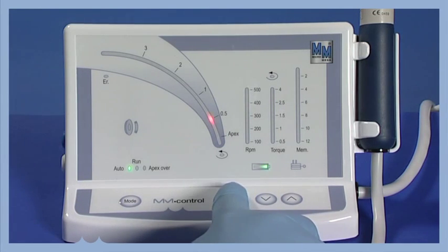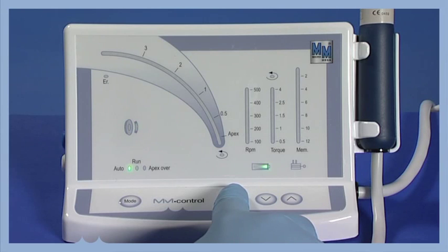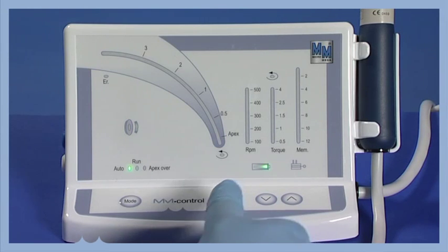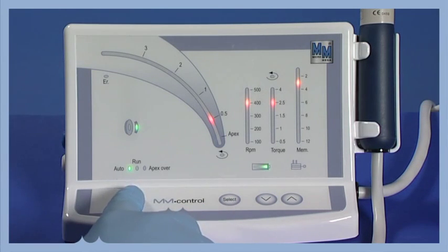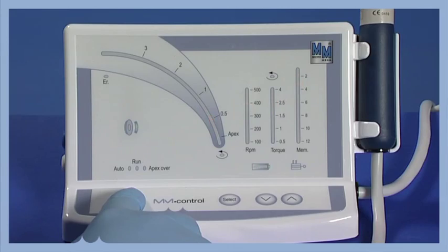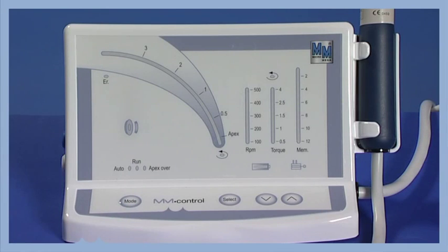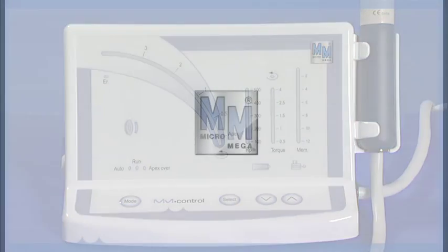Validate. The MMControl is stopped by pressing on the Mode button, or it stops automatically after five minutes of inactivity. Now that your programs are preset, you can do your root canal shaping.